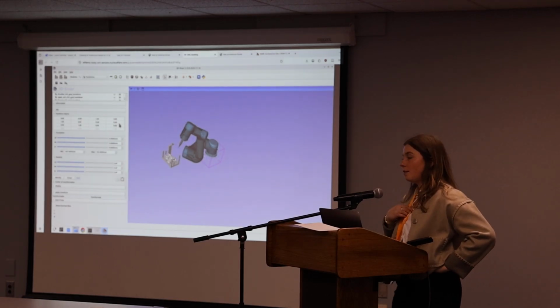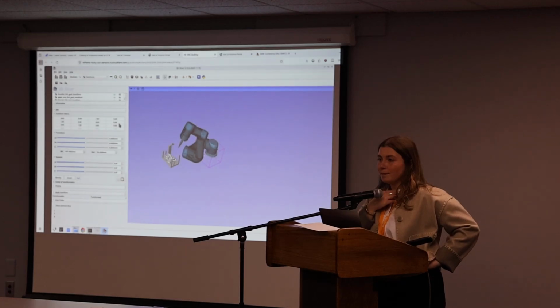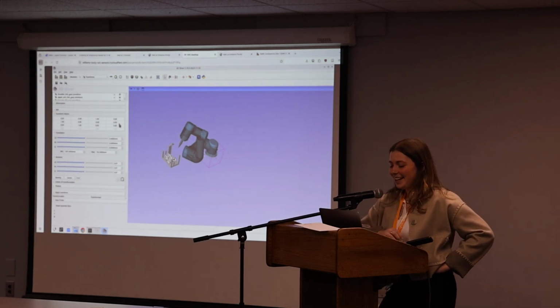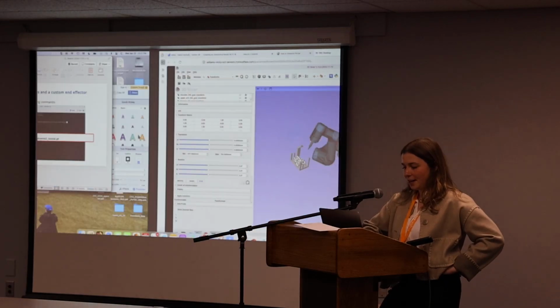Yeah, you can definitely add something like that. Our lab had some difficulties with that. They were trying to check registrations, and they'd say, oh, we look like we're close, and it says 2 millimeters, so it's probably fine. It's not perfect, yeah.